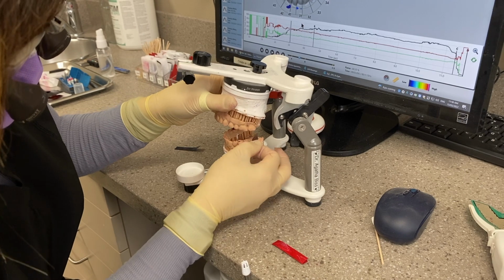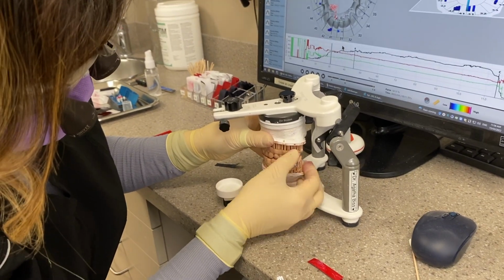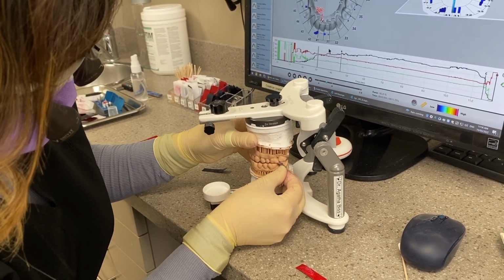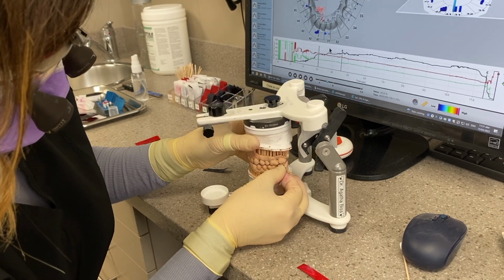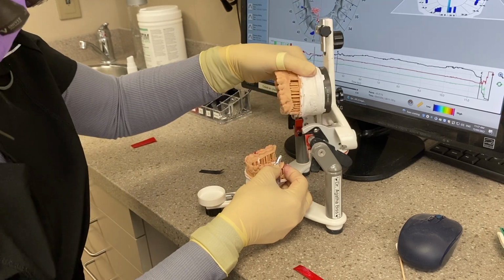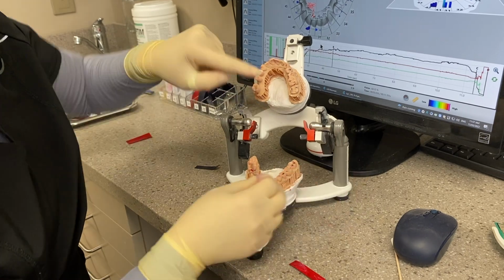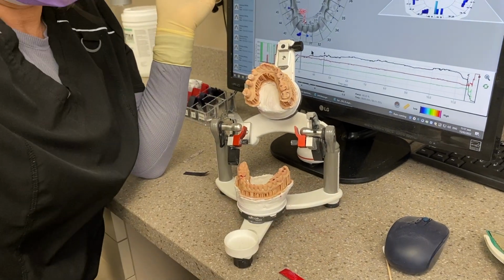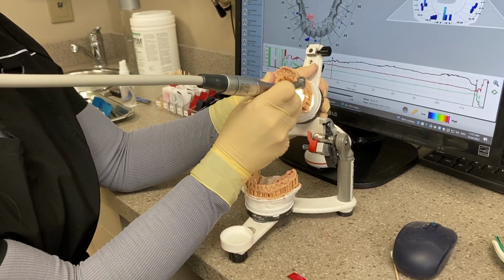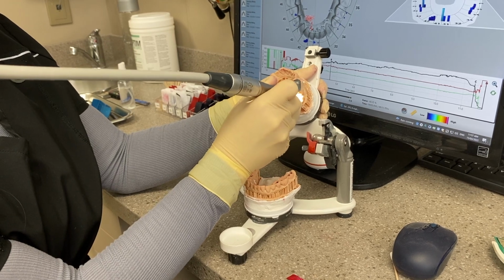Shim stock is thinner than articulating paper, so it's a really good medium to find where you're getting stuck, because articulating paper can sometimes mark so much. But somewhere right in this movement I'm getting stuck. So what is that? Looks like the marginal ridge of that 6, and that's the tooth that's also having significant bone loss in this area. So I'm just going to reshape that, tuck that in, get the buccal cusp out of the way.